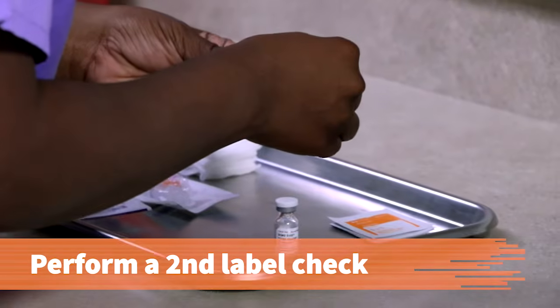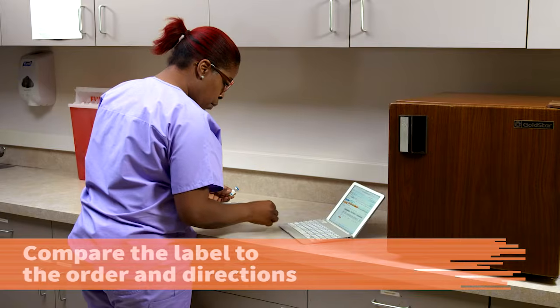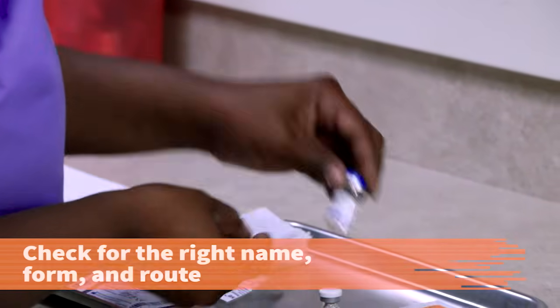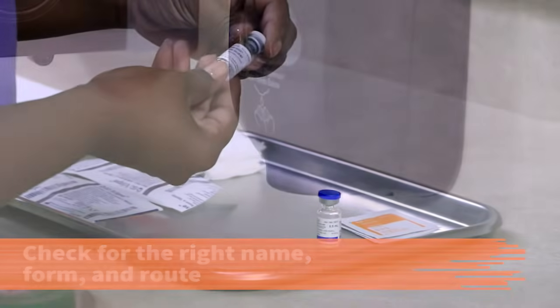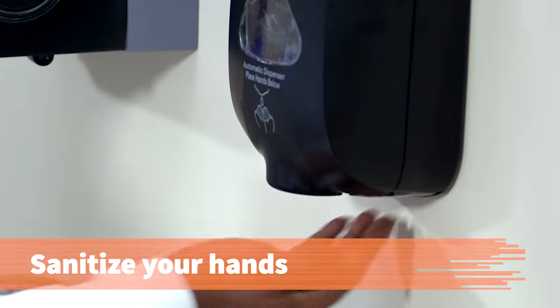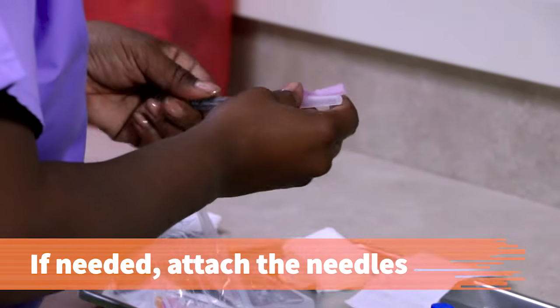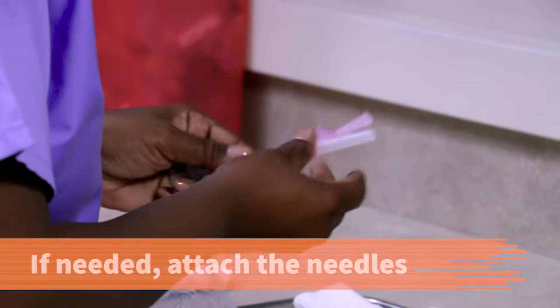Perform the second medication label check. Compare the medication label to the order and directions for reconstituting the powder. Check for the right name, form, and route. Wash or sanitize your hands. Open and assemble the syringes and needles. If needed, attach the needles to the syringes without contaminating the units.